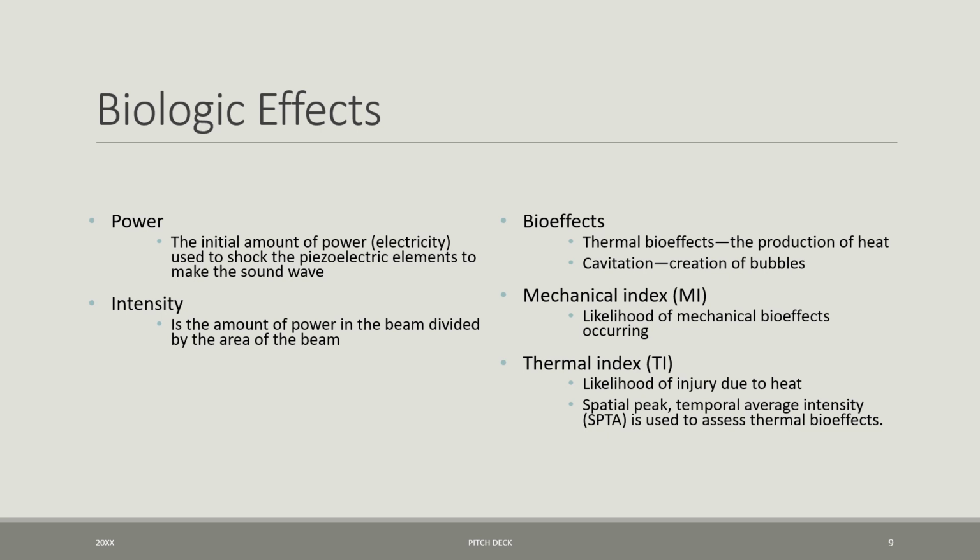However, when we look at how we use ultrasound and we talk about the duty factor that I spoke of a couple slides back, we know that really when we're scanning a patient, our percentage of time on is going to be very, very low. So while the theoretic effects are there, our true biologic effects are pretty minimal. It's really been demonstrated that ultrasound is very unlikely to produce any biologic effects to patients in the way that we use it. However, it doesn't mean that we don't need to be considerate of some of these different things that we may or may not be able to control.